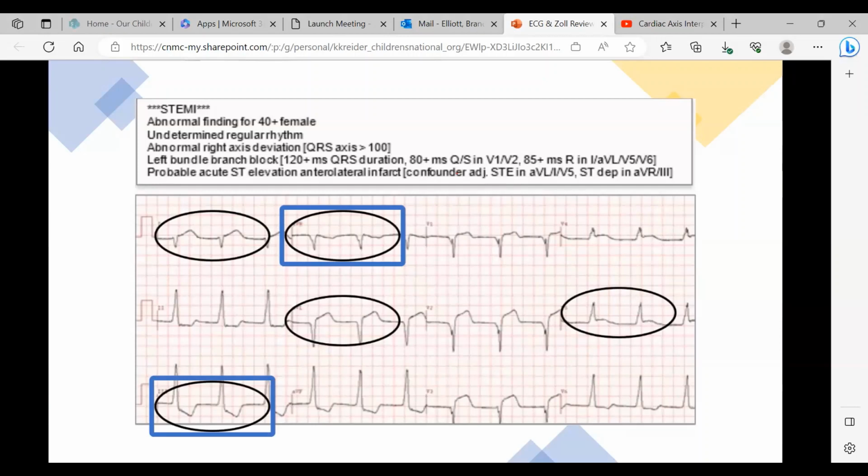So really, I need a part 2 on spending 2 days on bundle branch blocks. I don't think so, because you just gotta be able to see that there's a block. You don't necessarily need to know exactly about it. I think it would be more time consuming. Like, what else are you gonna do with it in the 30 seconds it takes me to get to the hospital center?